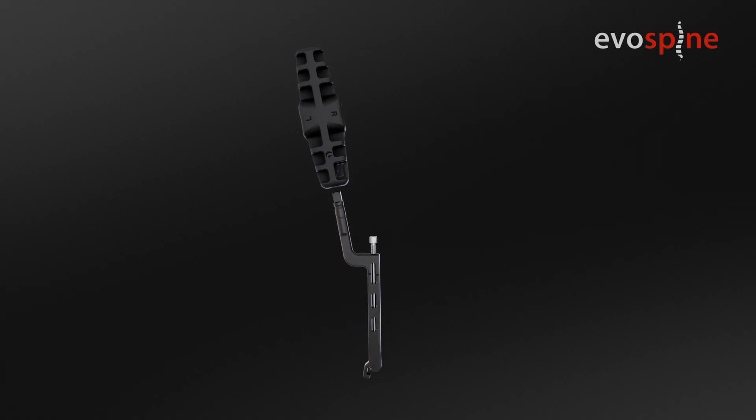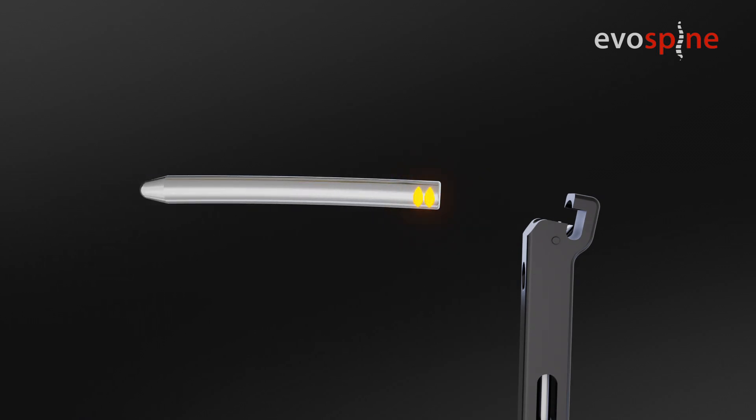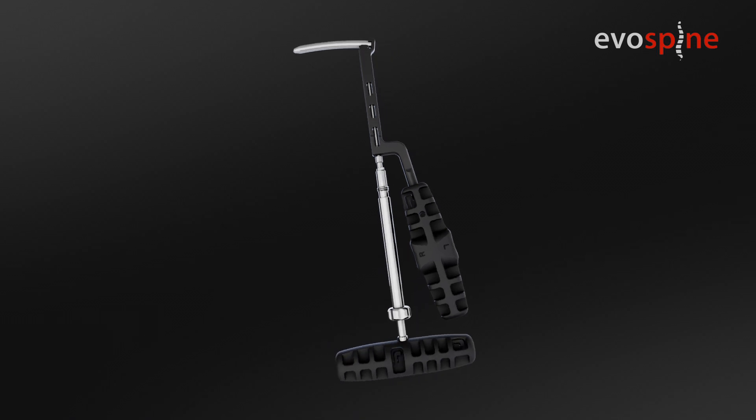Attach the MIS rod onto the rod holder. Place the rod holder upside down and place the rod inside. The laser marked line on the rod must be positioned towards the handle. Turn the tightening pin on the holder, first by hand, then tighten it with the screwdriver hex tip.